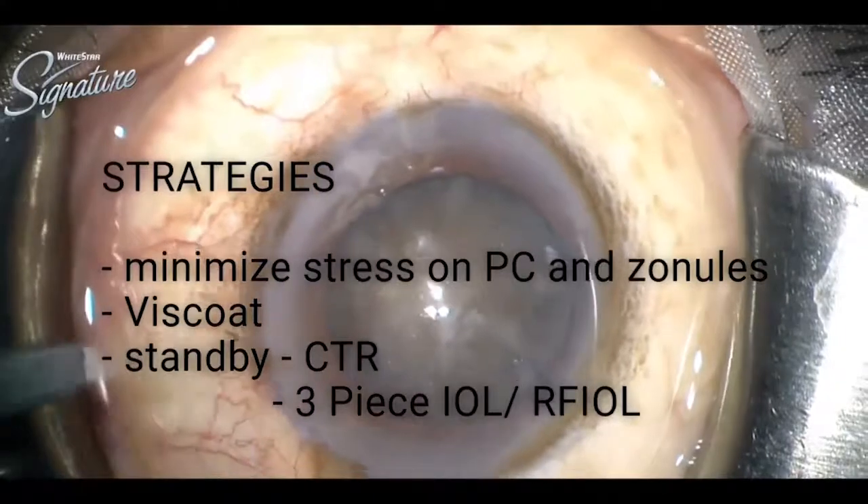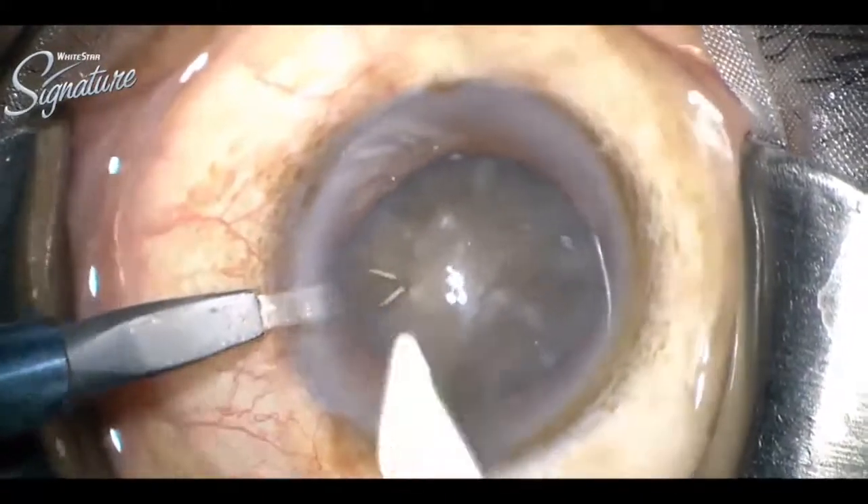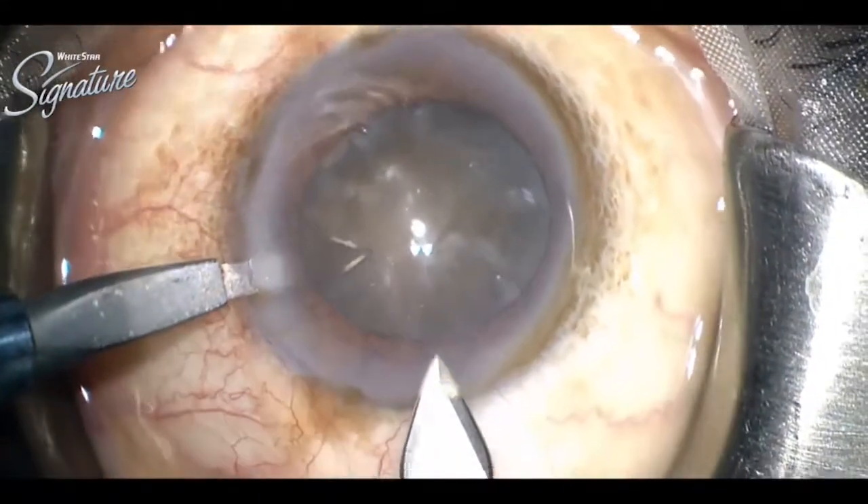This is a 73-year-old patient whose left eye was operated, who had a dense brown cataract with mild phacodonesis.